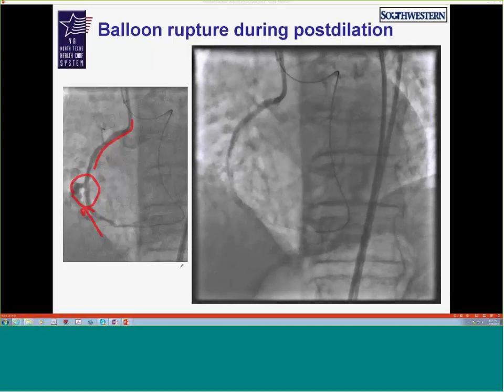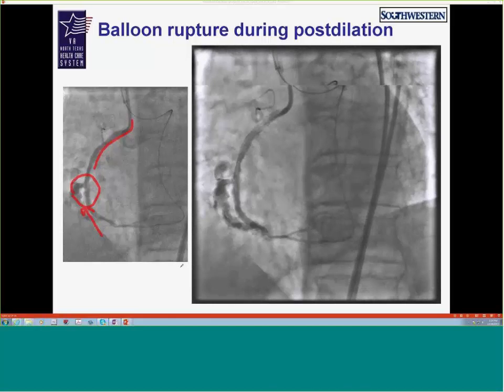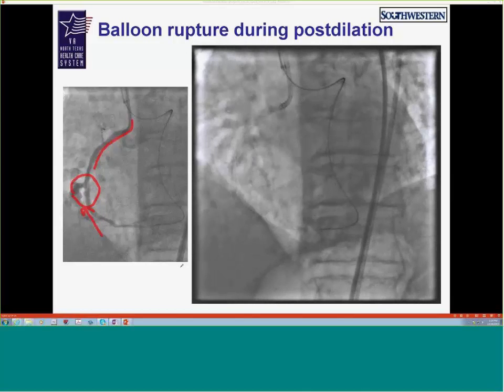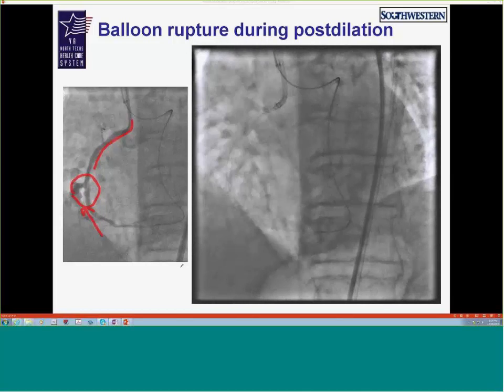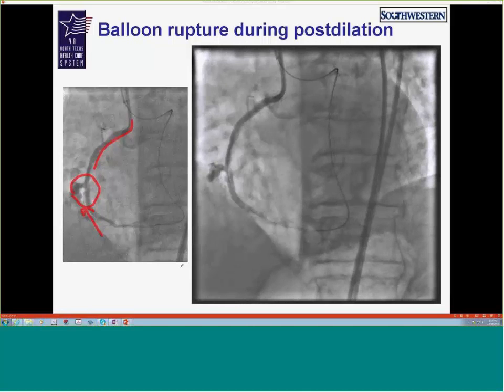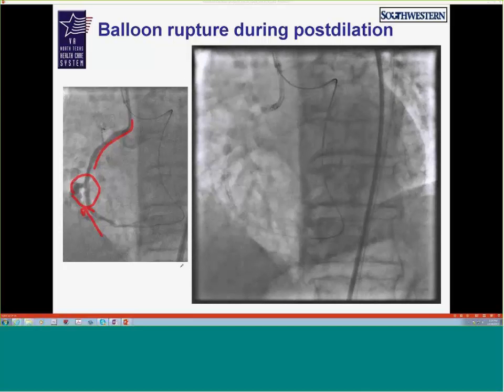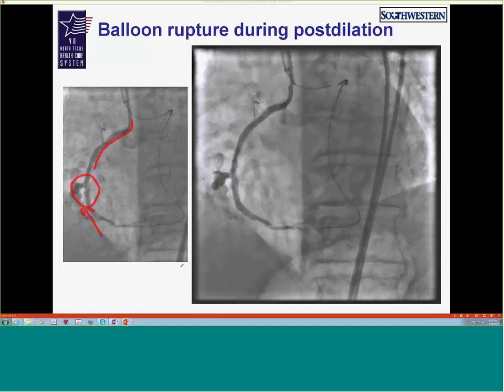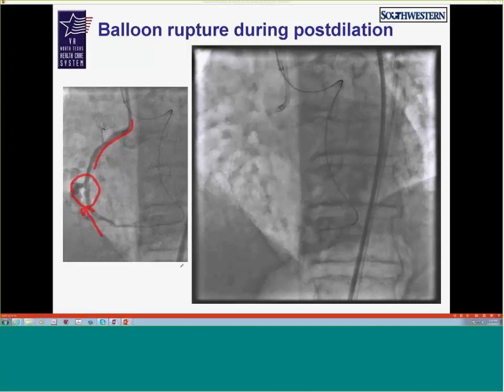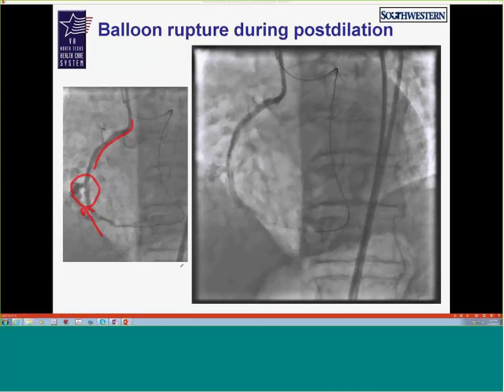And actually on echo, we did an echo, it was a hematoma on the artery wall. So obviously it's a big curve, but it's not exactly free flowing into the pericardium. So going down with the balloon for maybe 20 seconds a minute might not be as catastrophic as in an otherwise massive large perforation. How is he doing clinically?